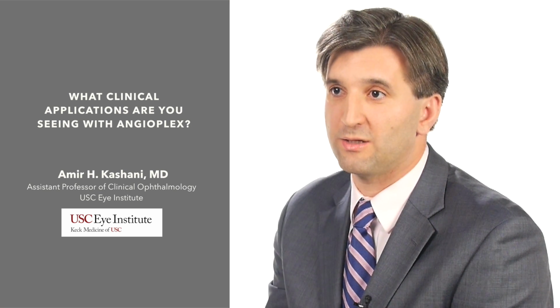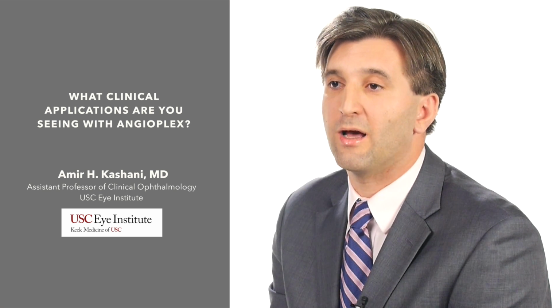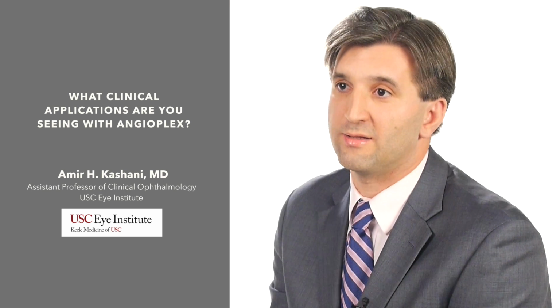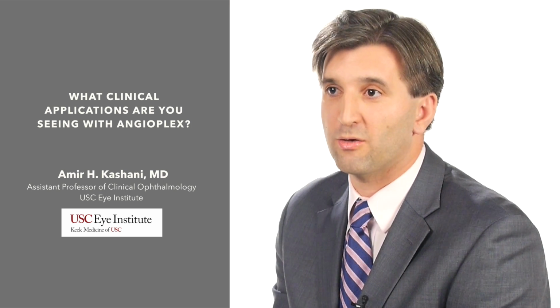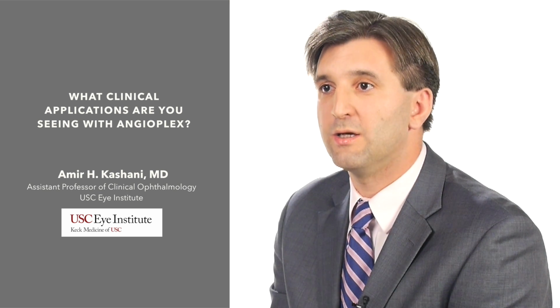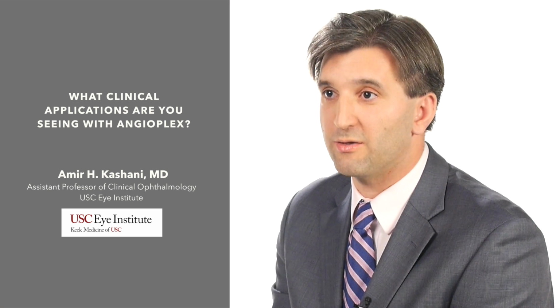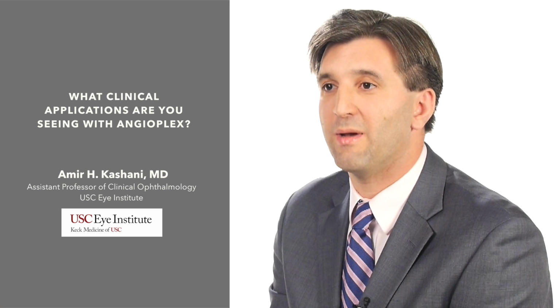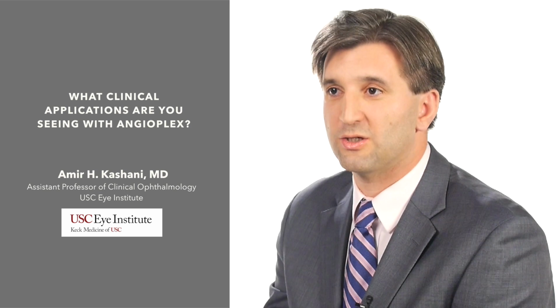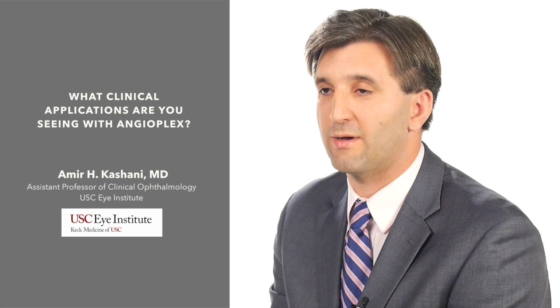So for example, in macular telangiectasia, one of our colleagues, Dr. Rosenfeld, has really been looking at the ability to visualize whether there is choroidal neovascularization or not in this disease. And it turns out that particular feature of the disease is kind of hard to tell on fluorescein angiography and clinically. So using OCT angiography, oftentimes you can see the choroidal neovascularization very clearly, and he's published a couple of papers about this. And if there is choroidal neovascularization, then we're really in a good position to recommend a treatment, such as an injection of an anti-VEGF agent to help stop the growth of those choroidal neovascular vessels.